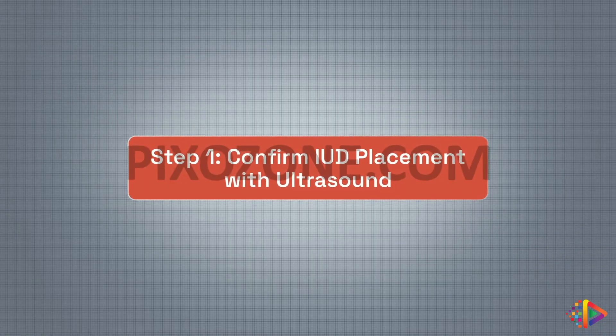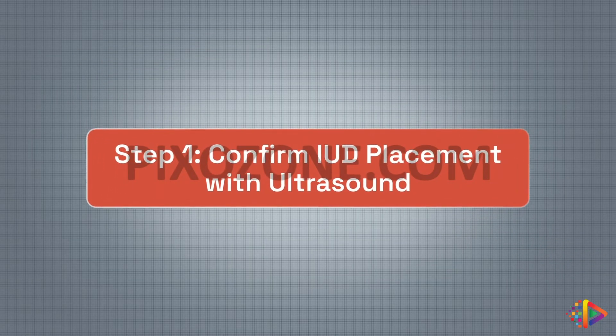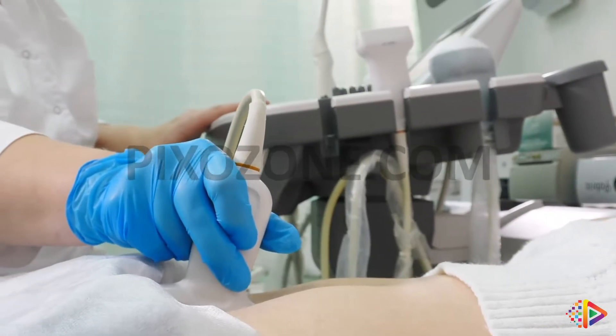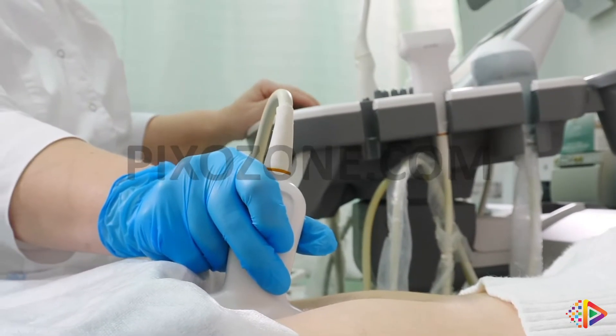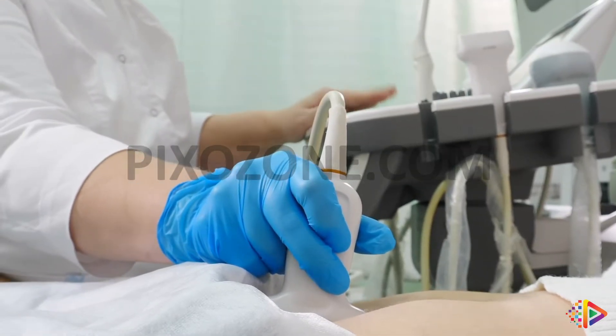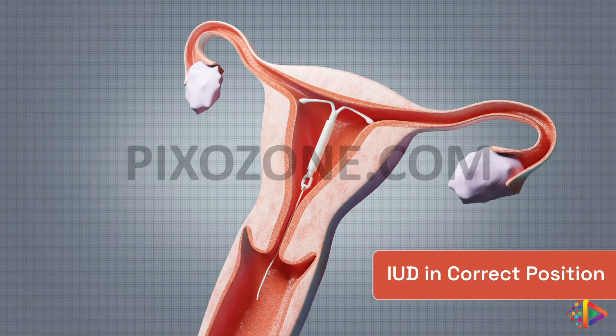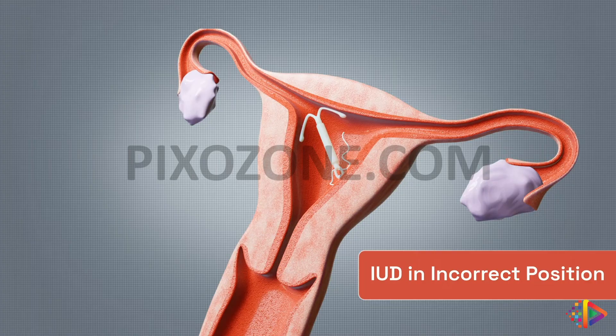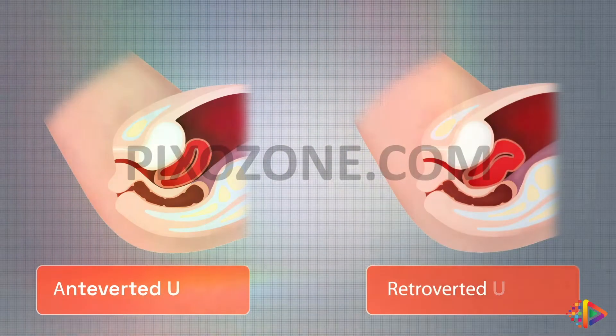Step 1: Confirm IUD placement with ultrasound. Before attempting IUD removal, it's essential that the patient has had a pelvic ultrasound to confirm that the device is still positioned within the uterine cavity. The ultrasound usually shows that the IUD is appropriately positioned, but sometimes it is malpositioned. It also tells you if the patient's uterus is anteverted or retroverted.